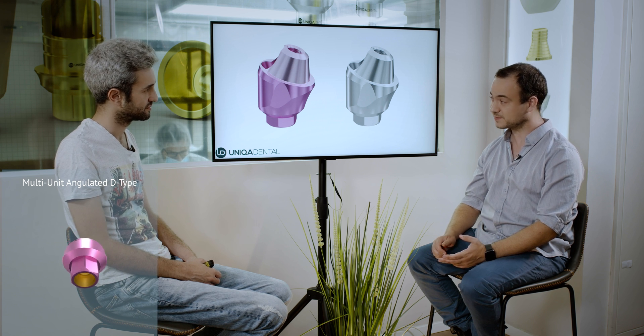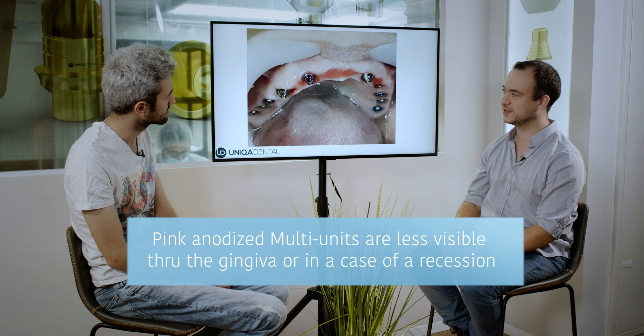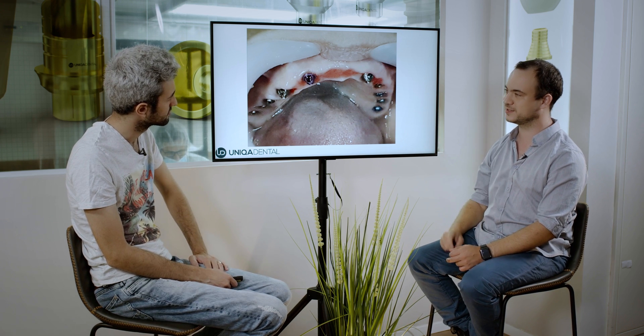So you have a very good bridge that looks very nice, but you can see the metal part of the multi-unit. That's why we started producing new colored multi-units. We chose to anodize the multi-units in pink color — tissue color — so that even though you have recession and the metal is visible, it will mask the reflection of the metal through the gingiva. If you have thin gingiva it reflects much less; you won't see the gray color you see in many cases with a titanium implant or titanium abutment. We took one, colored it, and used it for this specific multi-unit.